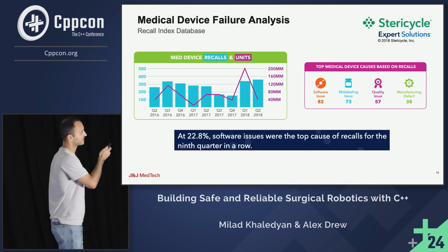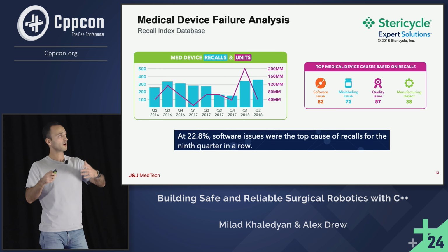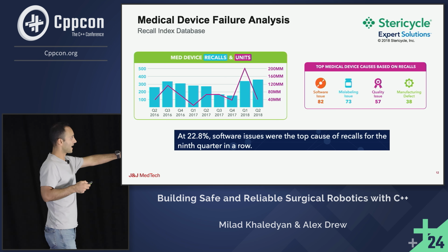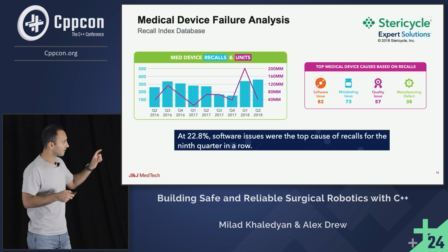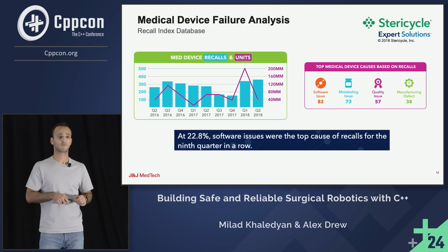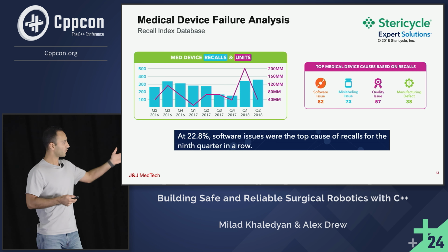Another database, from Stericycle Expert Solutions, has a recall index database for many different industries, such as defense, avionics, automotive, and also medical devices. This one is specific to medical devices. They looked at the data from Q2 2016 to Q2 2018, and again their conclusion was that software, for the 9th quarter in a row, was the top cause for medical device failure and recall. We have tons, millions, of medical device failures and recalls each quarter, basically.